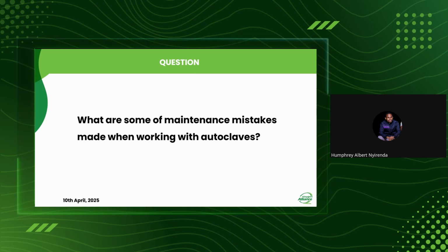One of the main causes of such instances is negligence of doing some cleaning within the machine, considering that the machine is partly electrical and partly water systems, the valves sometimes clog. So cleaning is quite necessary, and we don't have to ignore that guideline.